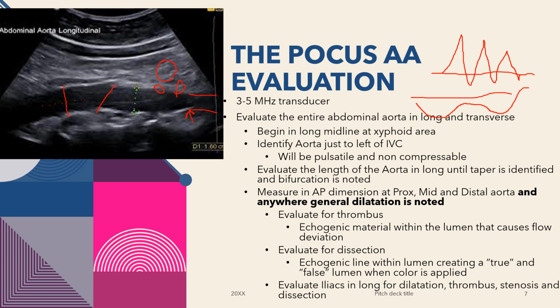One of the best practices that I was instructed on is that once you have the aorta in sight or visualized well, you want to turn your gain up so that your image becomes as bright as possible, and then you slowly taper off that gain, making it darker and darker until you feel like you've gotten rid of all artifact, but not of any information. And that's one of the best practices in both our B mode or black and white mode scanning, as well as in our color scanning.